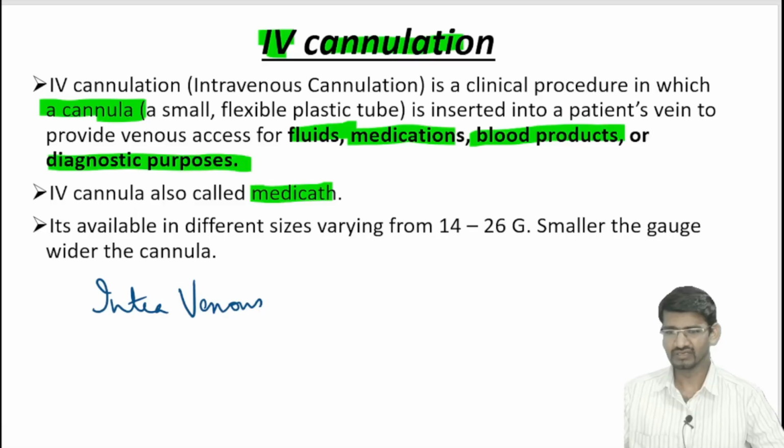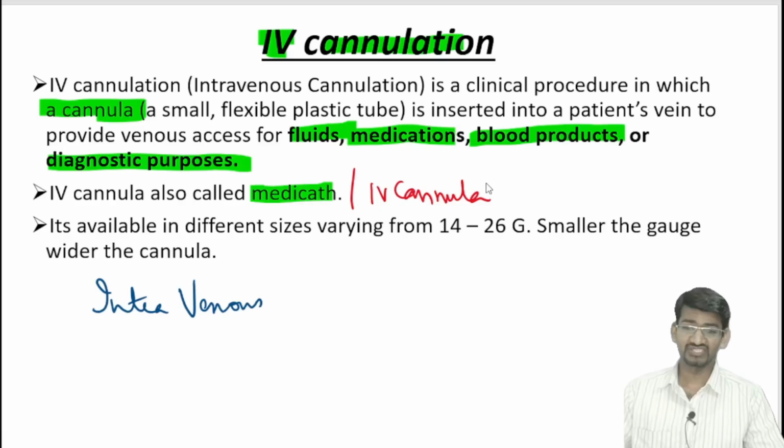In hospital we commonly call it cannulization, or IV cannula insertion. Generally we use these terms in the clinicals: IV cannulation or cannula insertion.